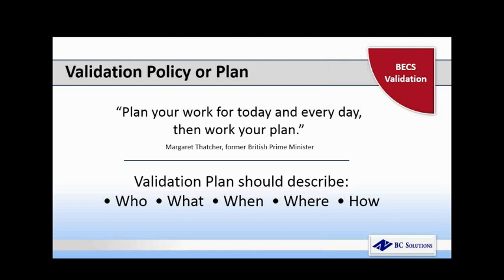You also need to determine how you're going to do the validation. Are you going to do it in-house, or will it be contracted out? If you decide to contract out your validation to a third party, you need to specify either in the validation policy and plan or in another document the qualifications that vendor needs to meet for you to select them.